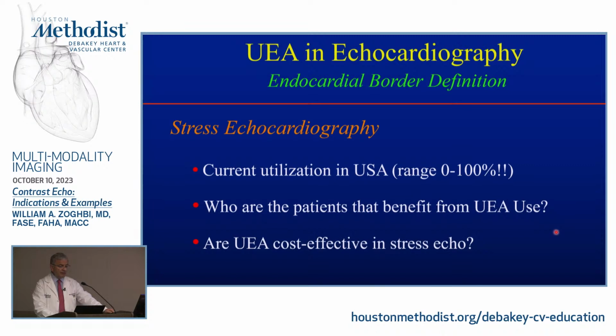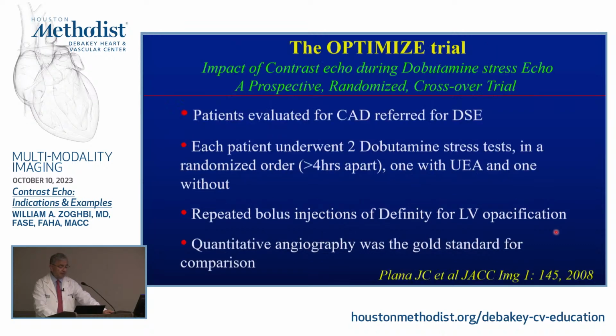This one hasn't changed either. I'm not sure about the zero anymore, but for many, many years, there were some labs not using contrast at all. I'm pretty sure if you go globally, that is definitely a true statement. There are some labs who use it 100% of the time, and I would not use it 100% of the time, for the reason I told you, and we have data to show you. And I'm pretty sure if it helps you, it is cost effective in a way.